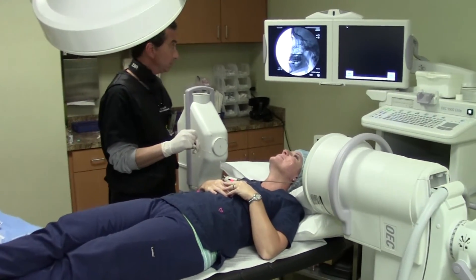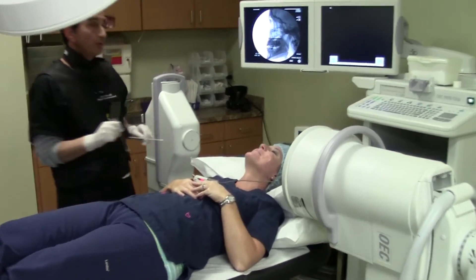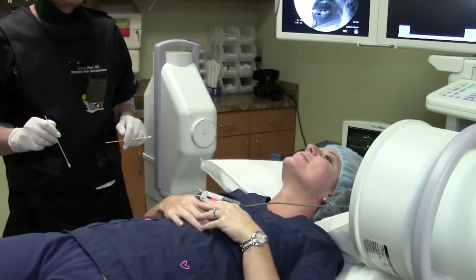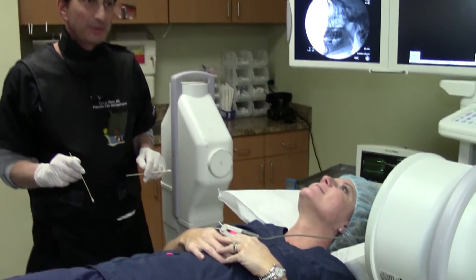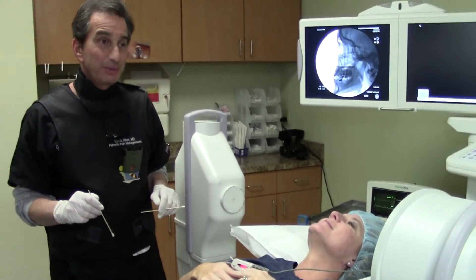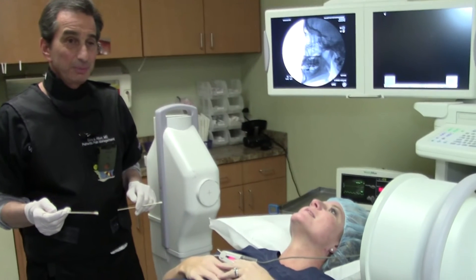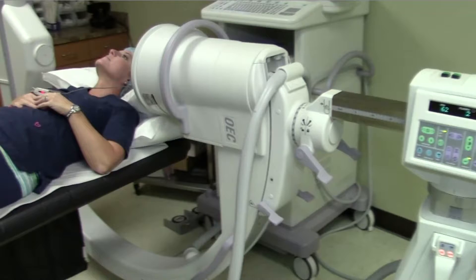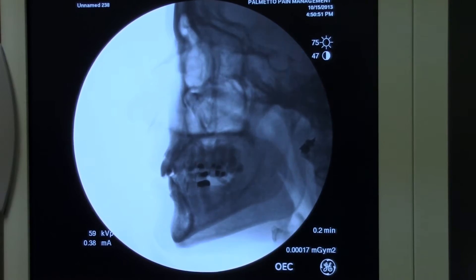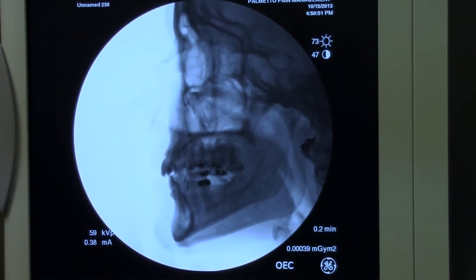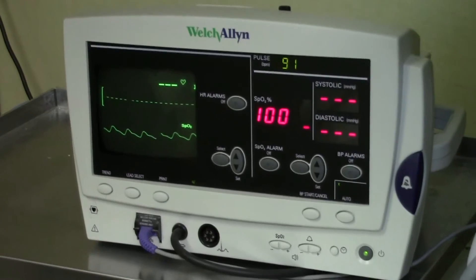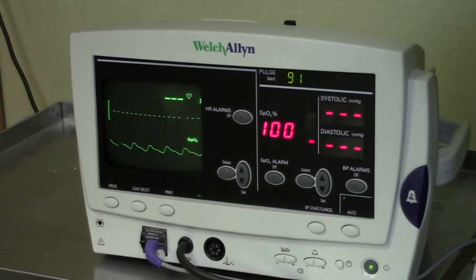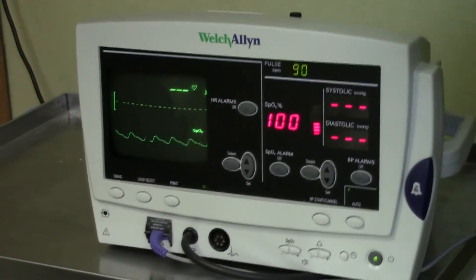She is here today to have the treatment repeated, and we are hopeful that she will have a good result once again. We have the patient lying supine on the procedure table. The C-arm is positioned for a lateral view, and we are monitoring her with a pulse oximeter.